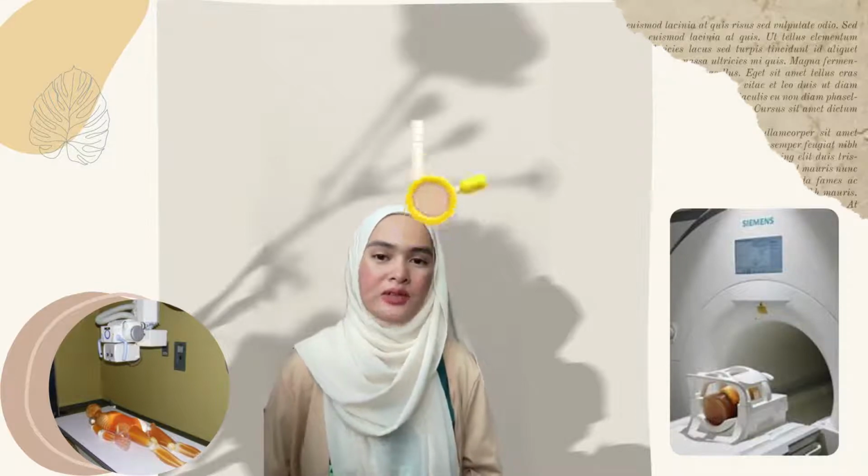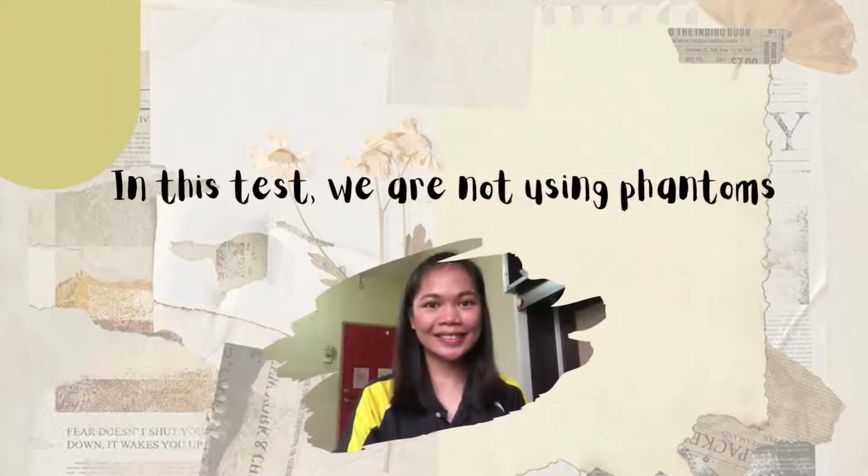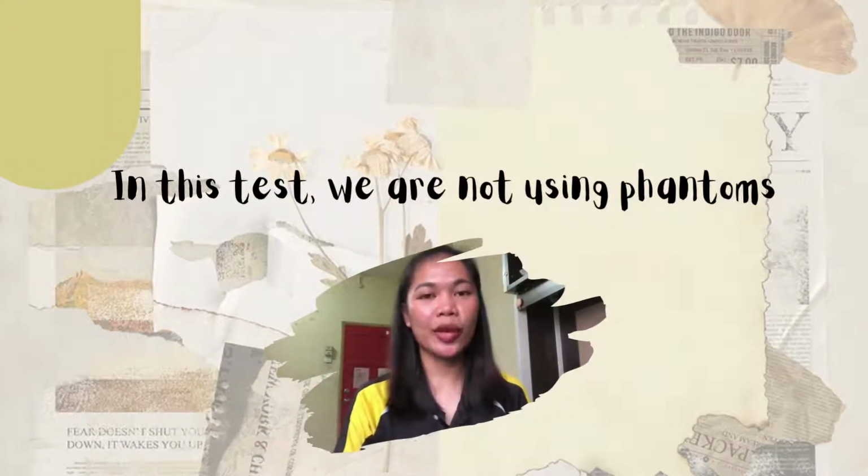Phantoms vary in degree of complexity and anatomical accuracy. Generally, the more realistic they are, the more expensive they will be. But do we use phantoms to test time exposure accuracy? Do you know what a phantom is? Measurements using phantoms are useful. In this test, we are not using phantoms.